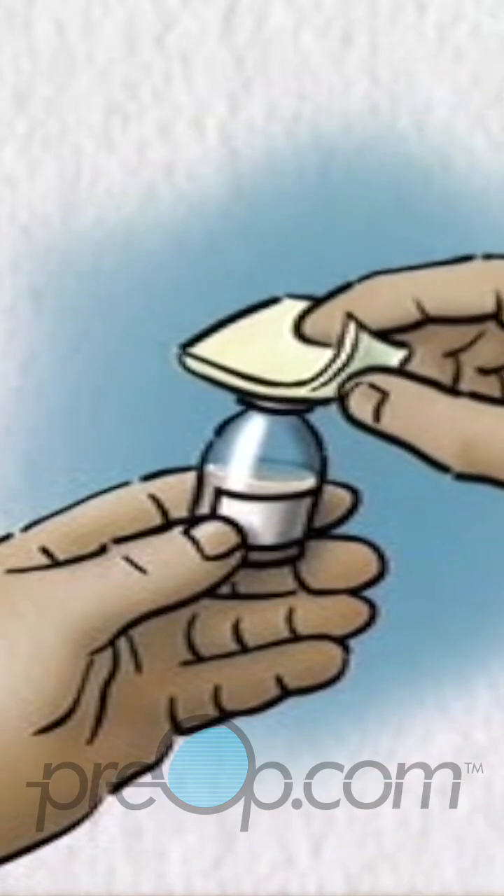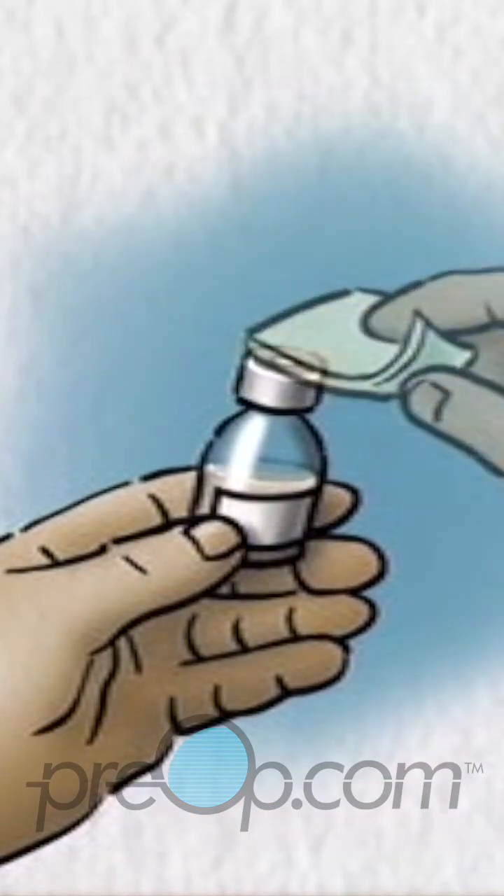Wipe off the top of the bottle with an alcohol swab. Discard the swab.